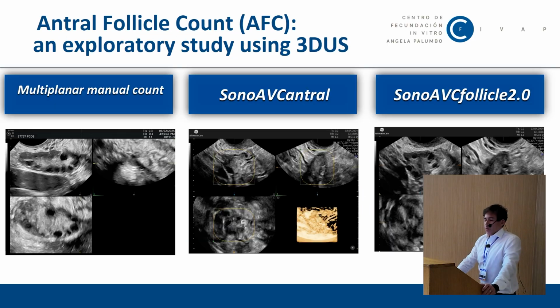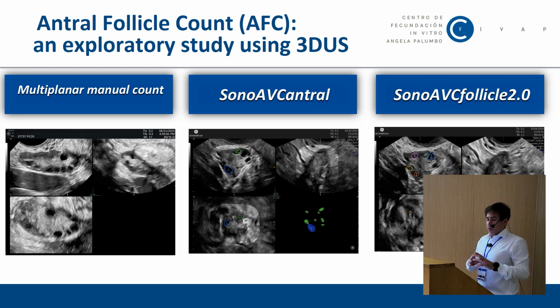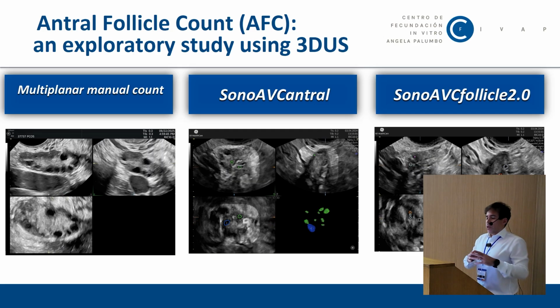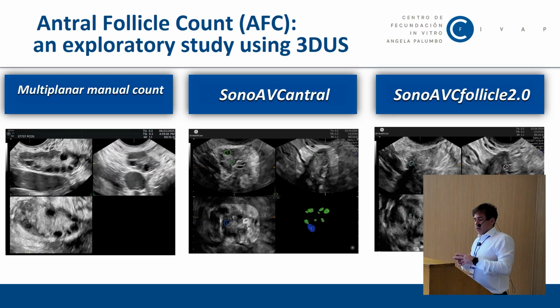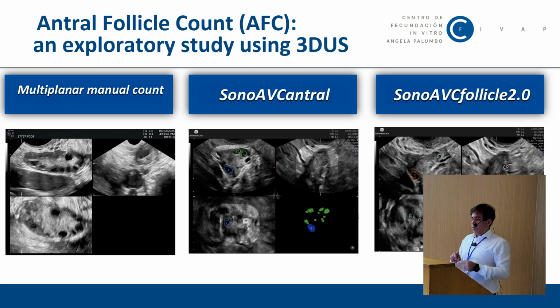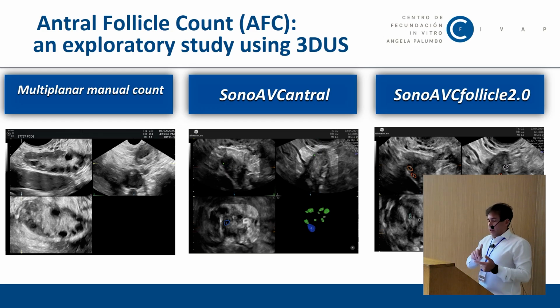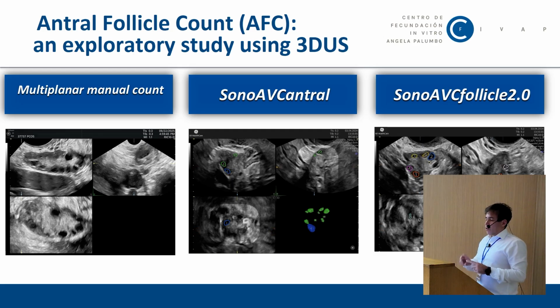And what we did, we already had the volume, and we did multiplanar manual count, SonoAVC antral, and SonoAVC follicle 2.0. And it was done by one operator, and this operator did the count in each one of the softwares 2 times.